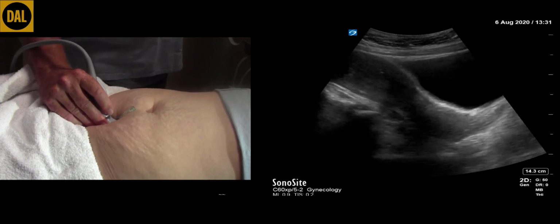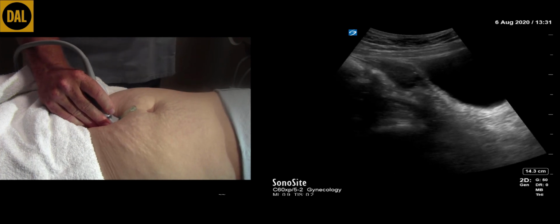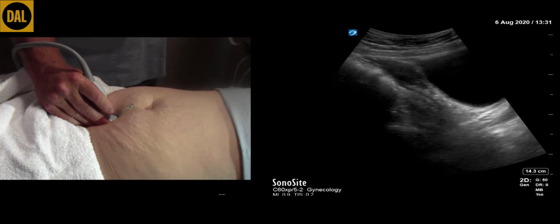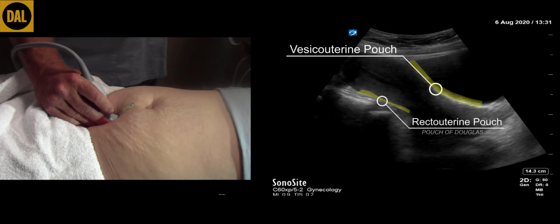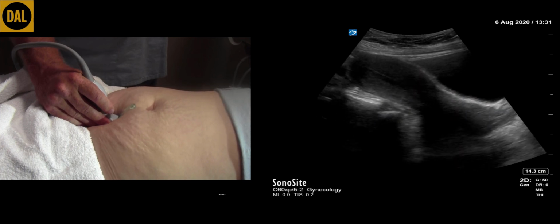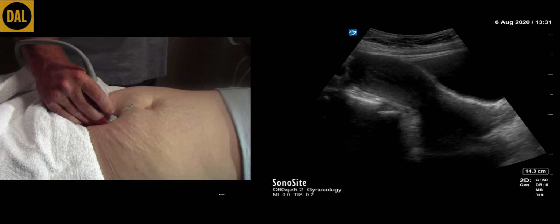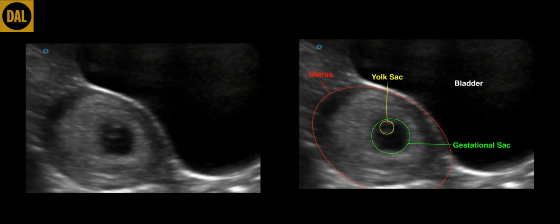Tilt the transducer to the patient's right and then to the patient's left, carefully examining for the presence of free fluid in either the vesicouterine pouch or the pouch of Douglas. Also, in patients with a positive pregnancy test, carefully examine the endometrial stripe for the presence of a gestational sac. This is one of several important factors when considering the presence of an intrauterine pregnancy. This completes the scan of the female pelvis.